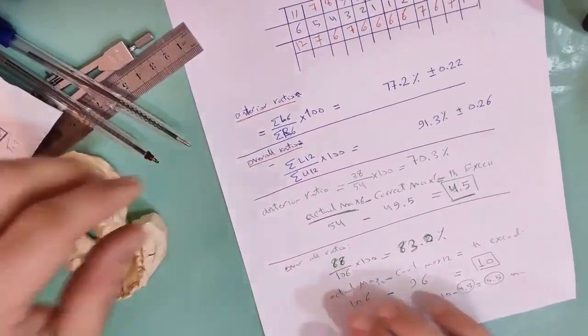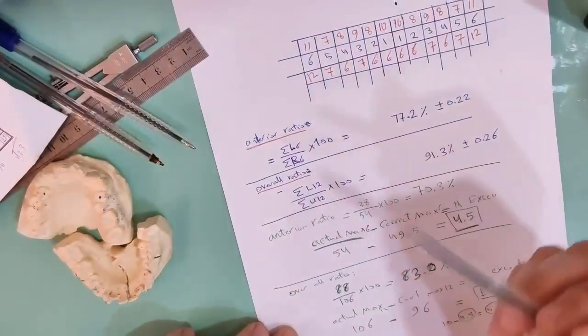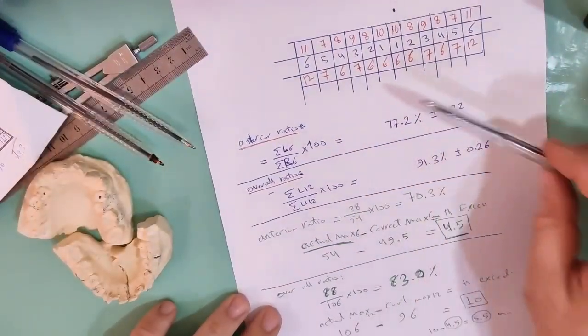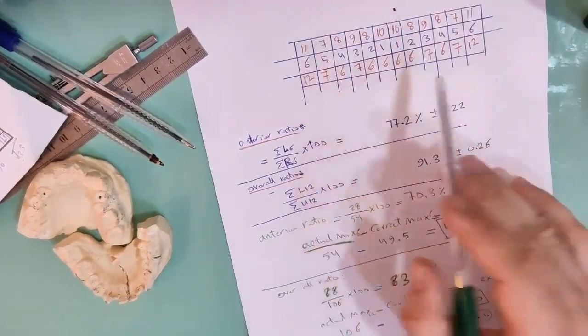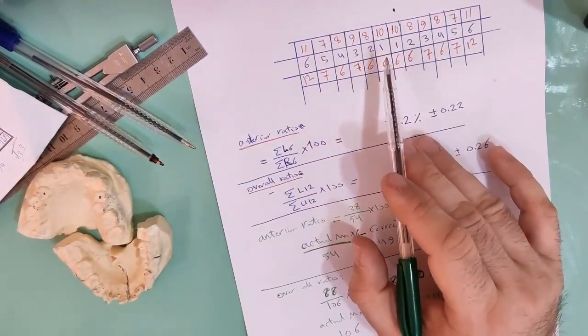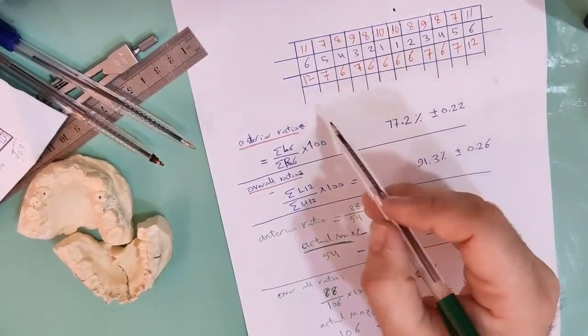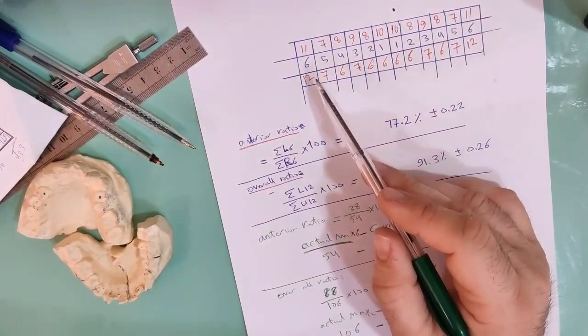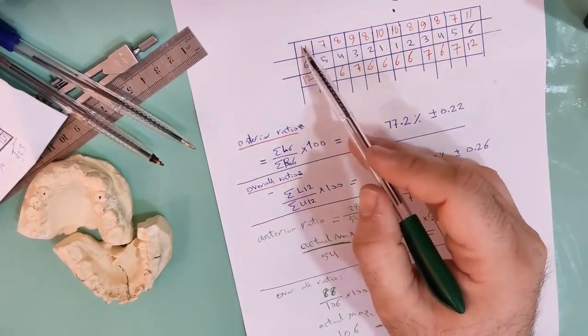This is the Bolton analysis and how we do it. To finish, we calculate the lower 6 and upper 6, then the lower 12 and upper 12.